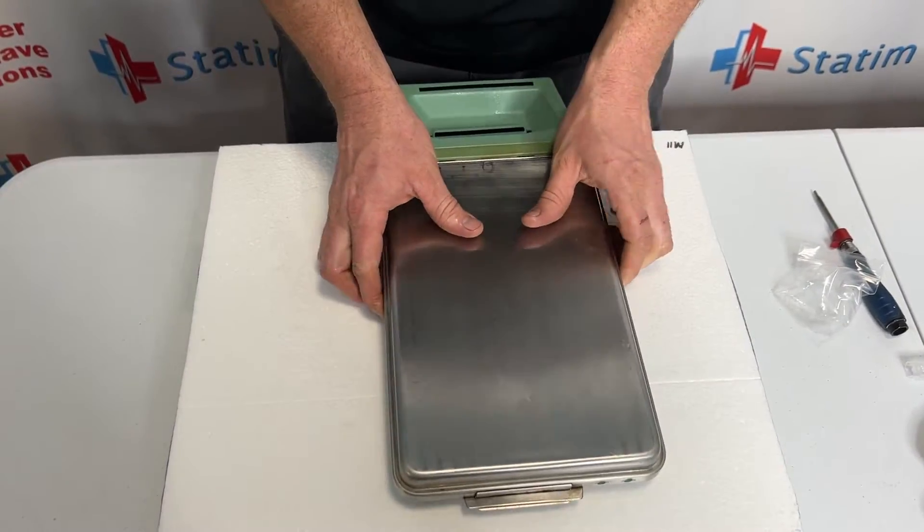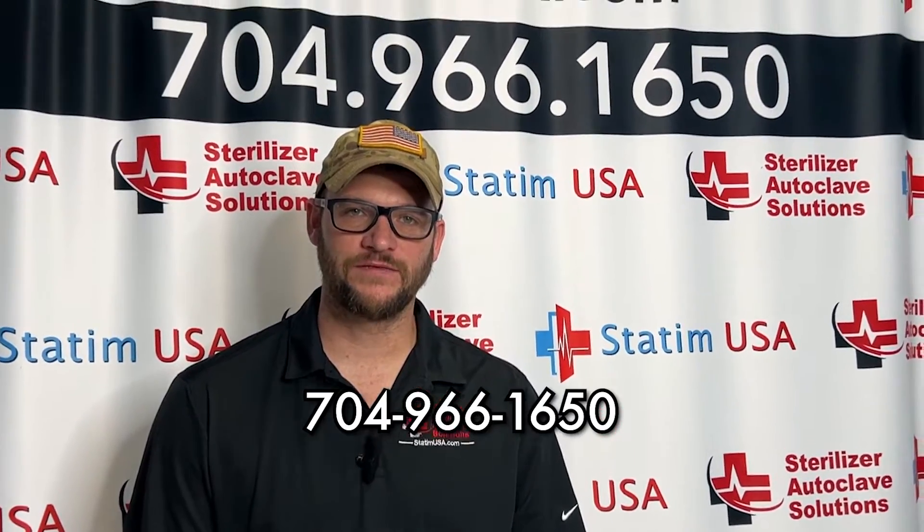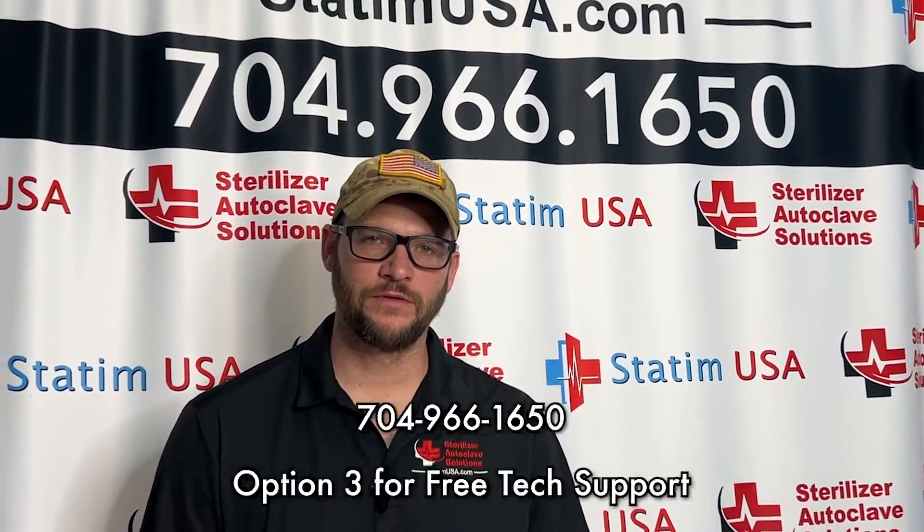Give it a nice little squeeze — you should hear air blowing out the back. If you have any issues, please give us a call at 704-966-1650, option 3 for free tech support. Thank you.